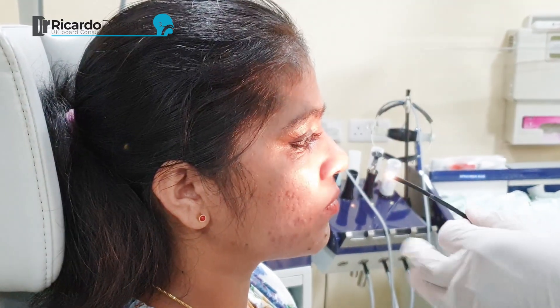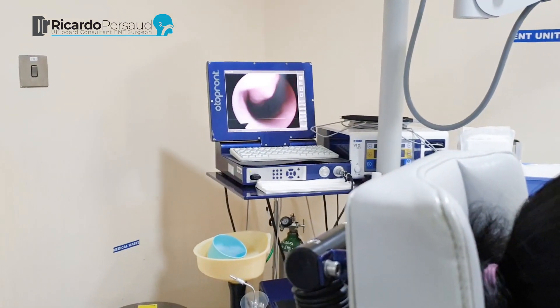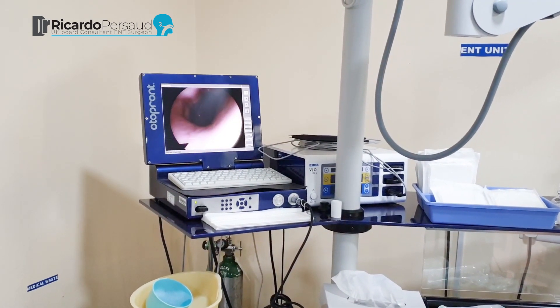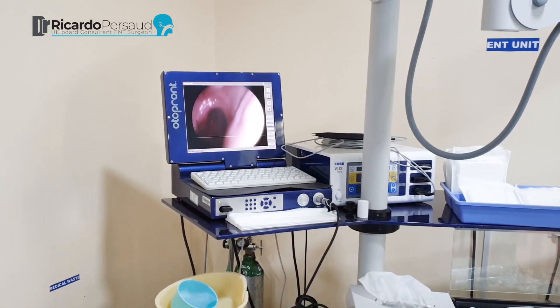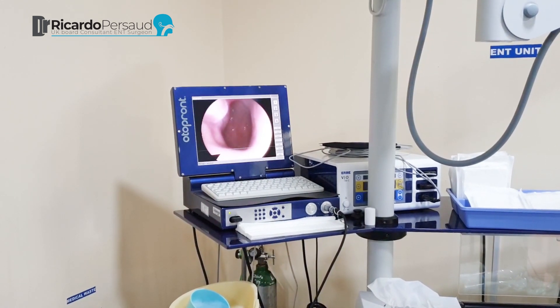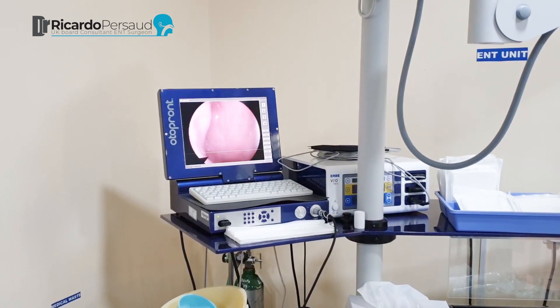So if I put the nasal endoscope in like this, you will see that you go straight down to the back of the nose. It's to get to the nasal pharynx to take the sample. You want to be in this area here — not here and not here, not up. This is the floor of the nose that you are aiming along to get to the back of the nose. This is the nasal pharynx, and this is the area that you want to sample.